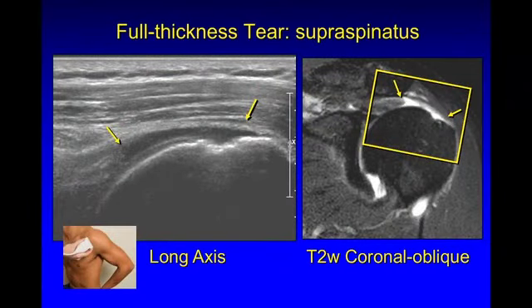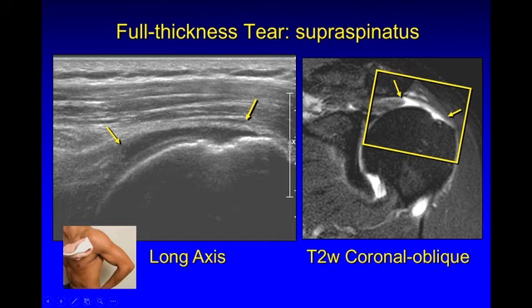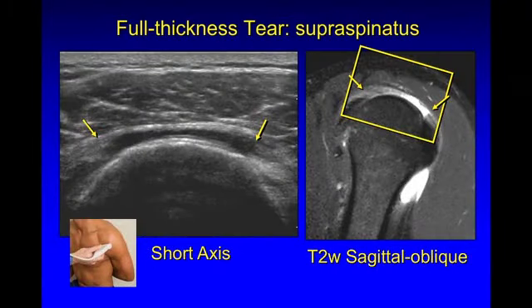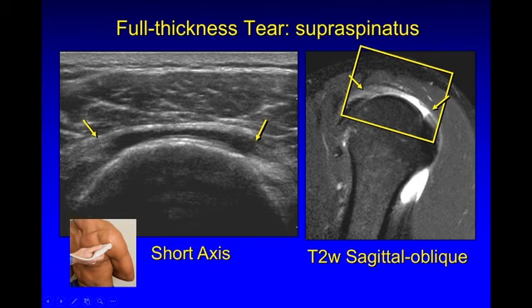As the tear gets larger in this next example, we see further retraction of the tendon from where it should be attached. There's the hyaline cartilage, the fluid-filled defect. Note the flattening as the deltoid is laying down into the torn tendon gap — yet another indirect sign of a rotator cuff tear, which is volume loss of where we expect to see the rotator cuff. On MRI, the same example and the same imaging findings. Here in short axis of that same patient, we see this is not just a full thickness tear but a full width or complete tear of the supraspinatus, where the entire tendon is torn from anterior to posterior.